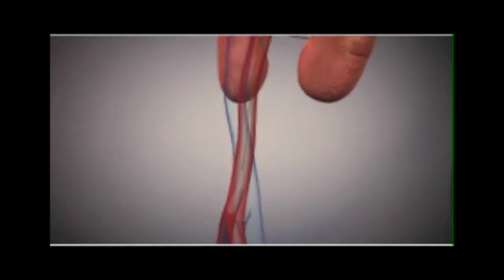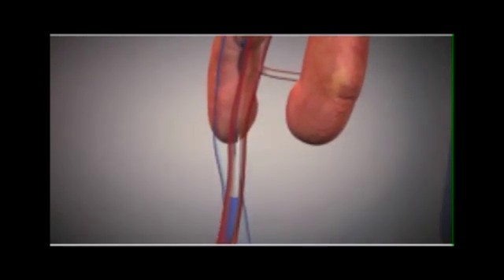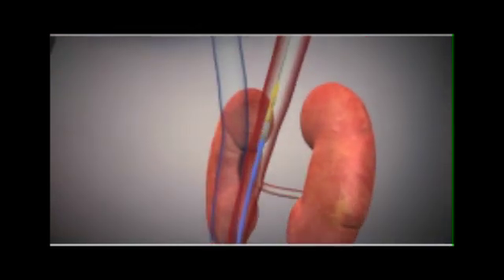After the valve is balloon dilated we remove that balloon and then we pass a larger tube up to facilitate the implantation of the valve itself.